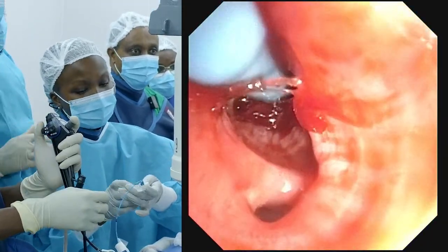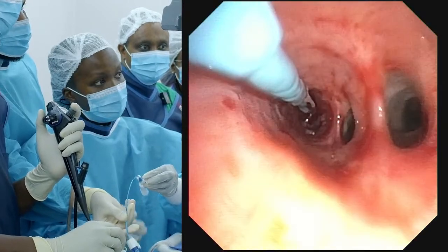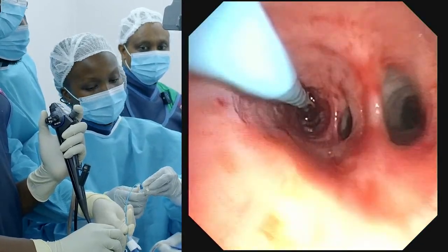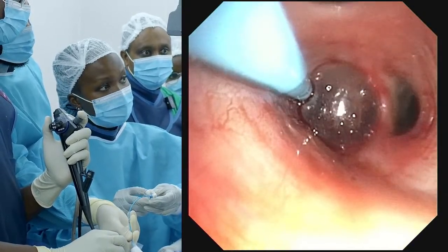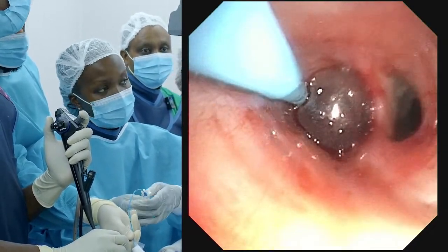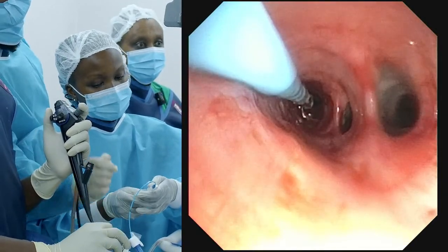Let me just press the balloon. So you're going to make sure you can see the tip of the balloon. Yeah, like here is good. Now inflate it there. Good, good. Can you see that? That's the bronchus. This is the whole segment. That's fine. That's what I like.